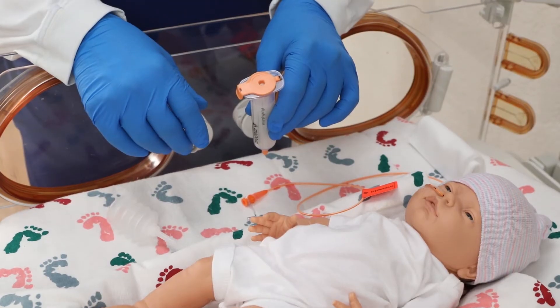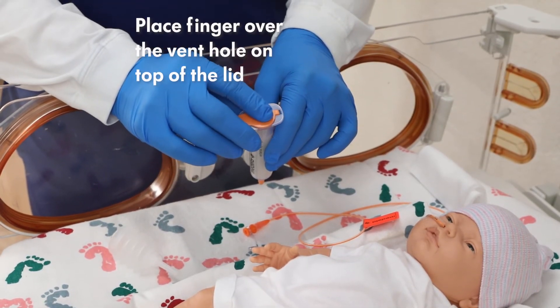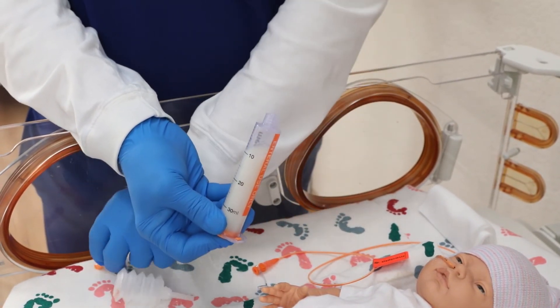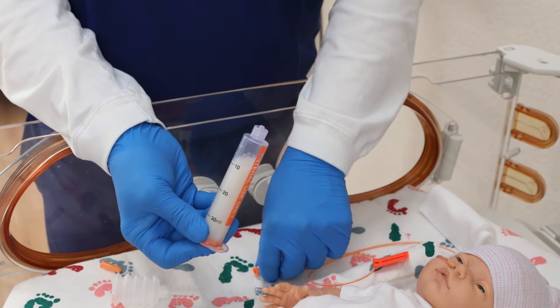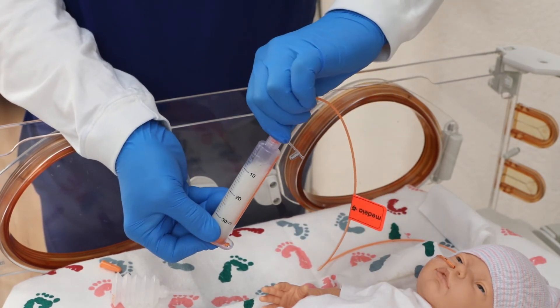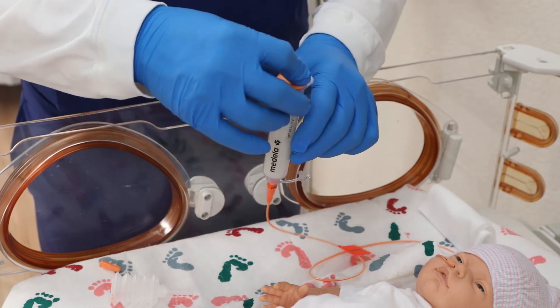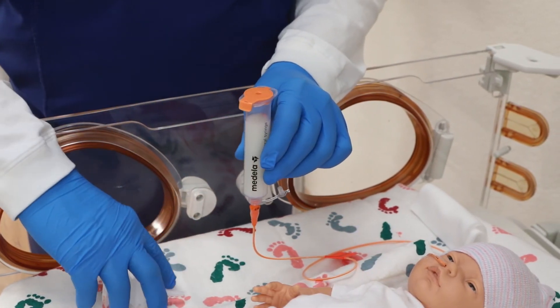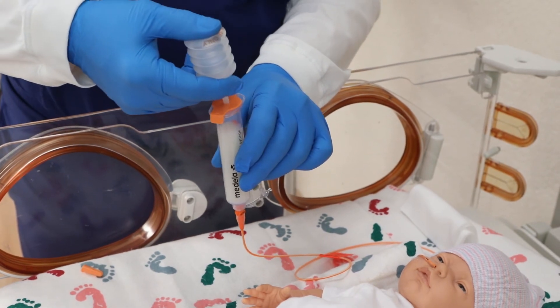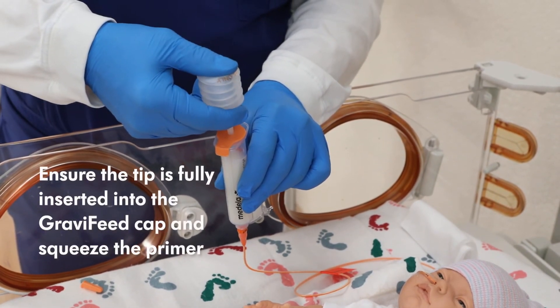When connecting to the feeding tube, place your finger over the vent hole on top of the lid. Invert the Gravifeed syringe and remove the non-vented cap. Turn the Gravifeed syringe vertically with the lid side up after connecting to the feeding tube. Use the primer to start the feed. When using the primer, ensure the tip is fully inserted into the Gravifeed cap and squeeze the primer.